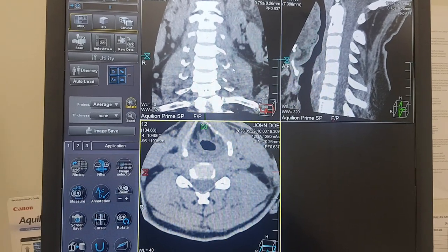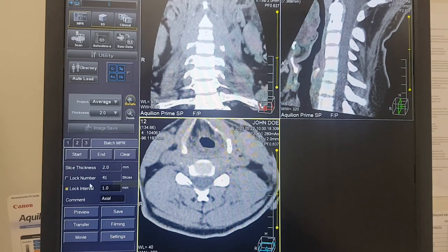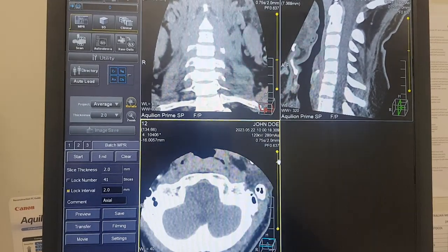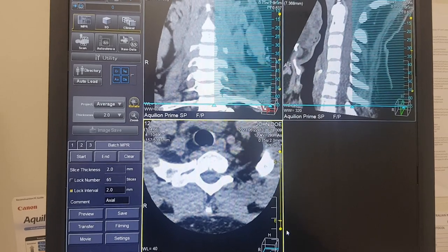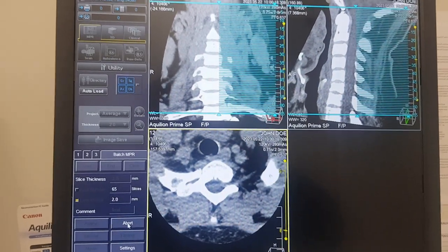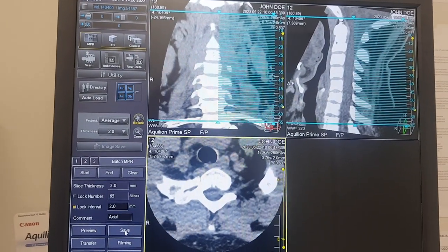We just straighten up the axial and coronal, then make a batch 2x2s. Make sure you go through from the base of skull down to T1 — you'll know where T1 is when you get to a rib. We save those.